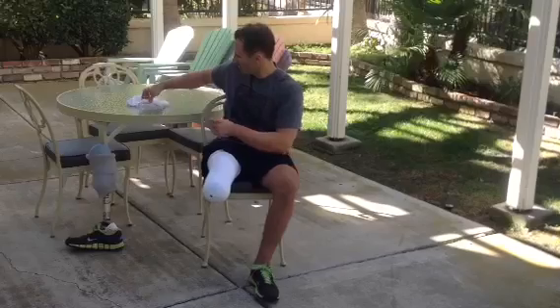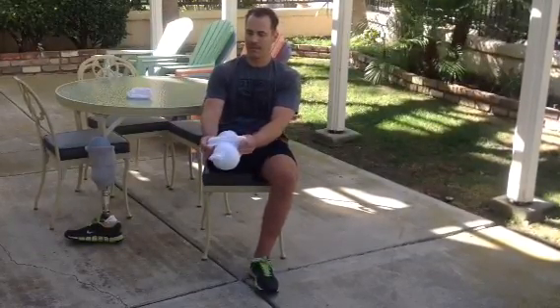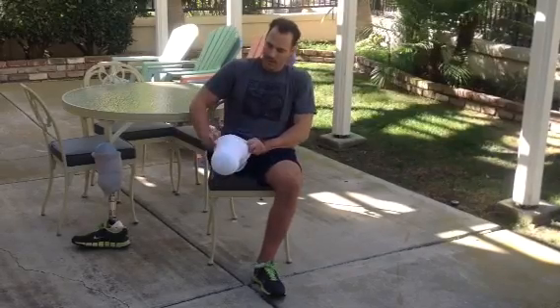There's one. There's two. And there's three.